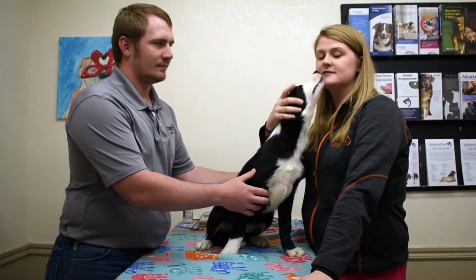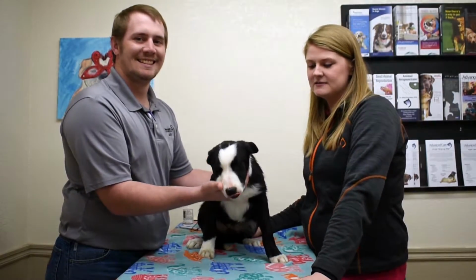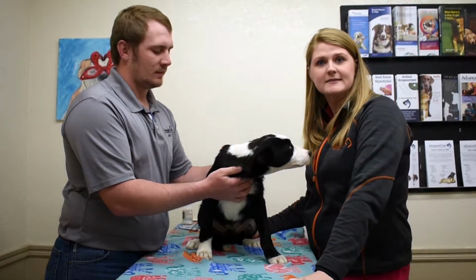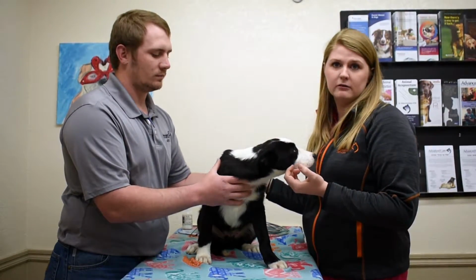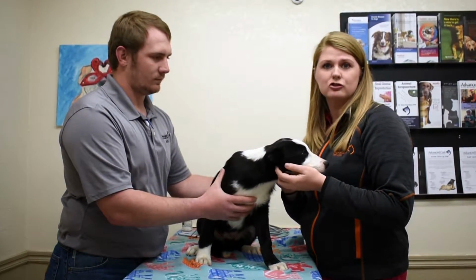So BAER testing is brainstem auditory evoked response. Basically what that means is it's the measurement of the ability of the dog to hear by using their neurologic system as a test. So we attach some leads and create a stimulus that gives a sound, and then they should respond on a little machine that we have and show us peaks and waves and things like that that show that they can hear.